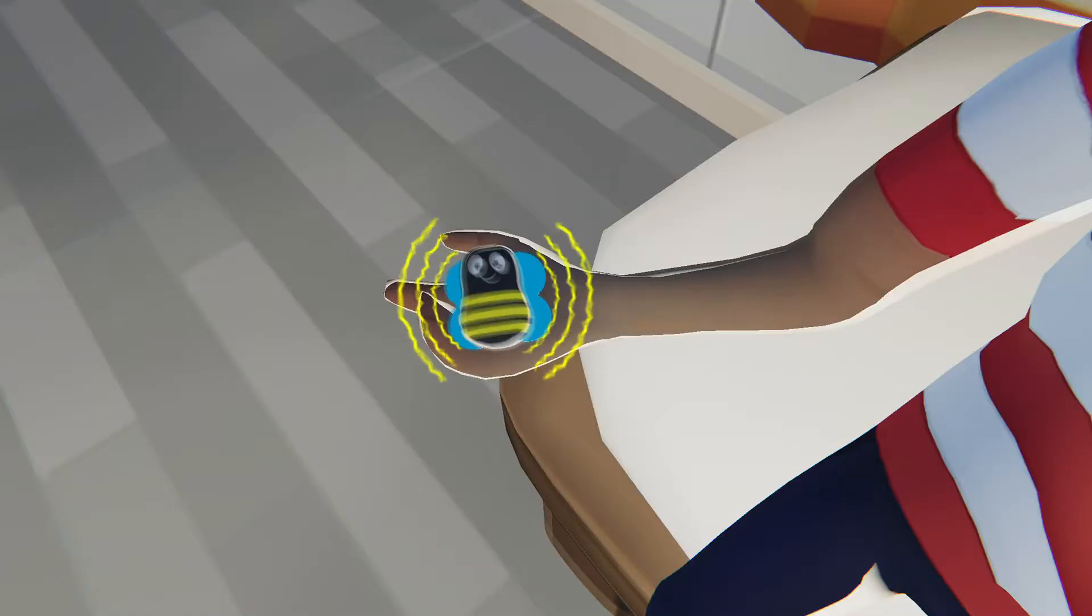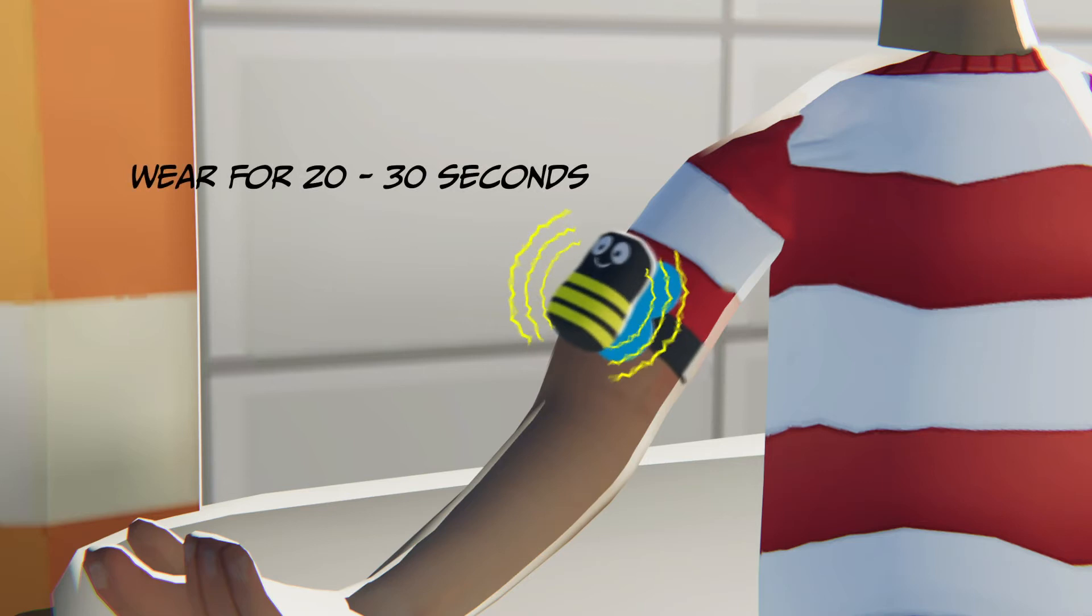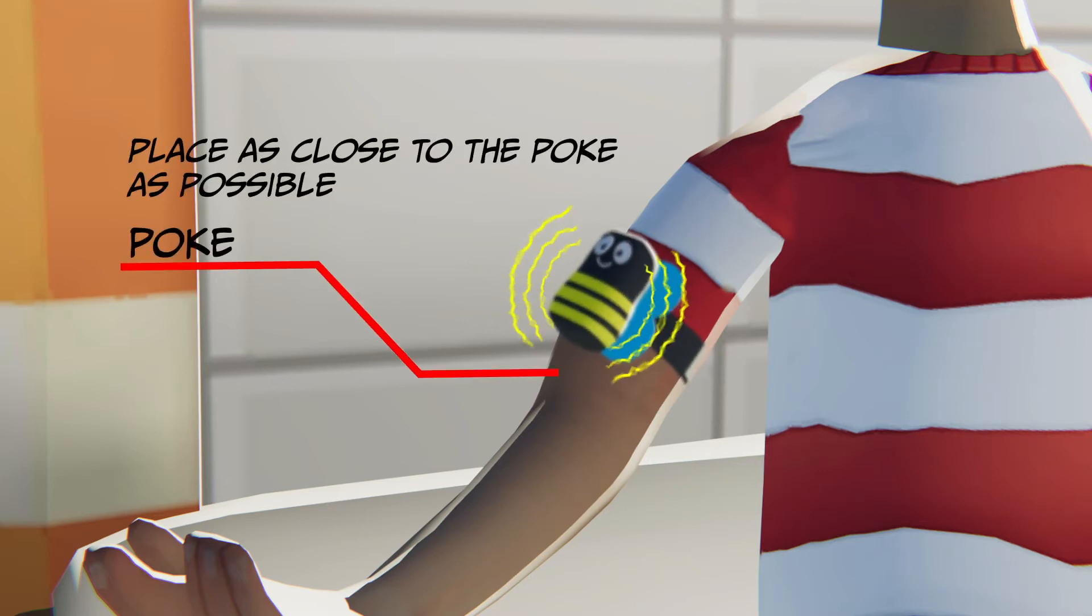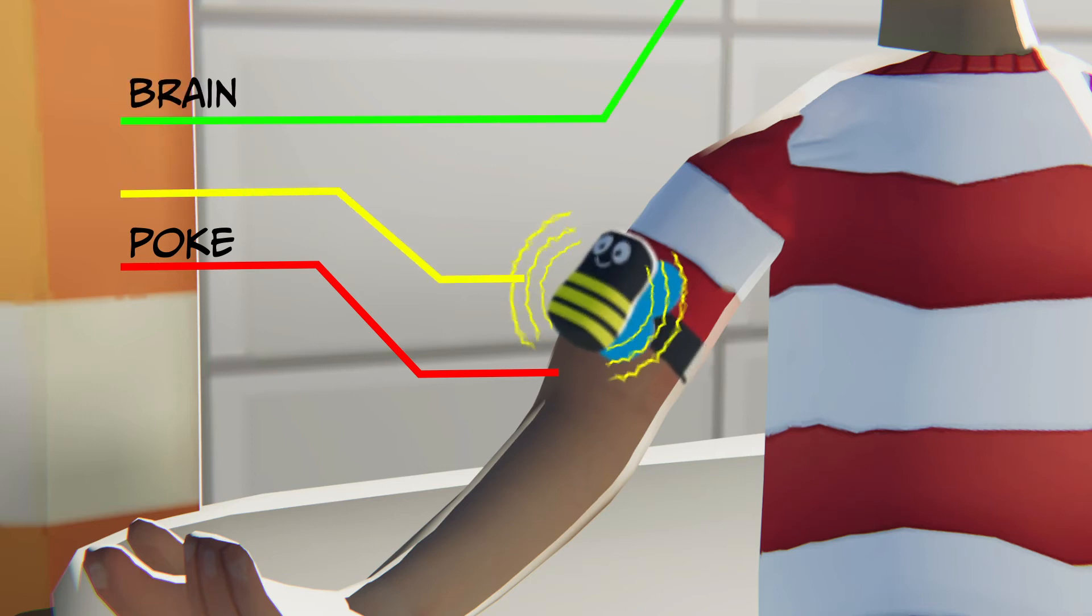For kids, it's super helpful to let the child play with Buzzy before so they can get used to the sound and the sensation. You should hold Buzzy on the skin for about 20 to 30 seconds before the poke. Place it as close to the poke as possible. It just needs to be between the poke and the brain.